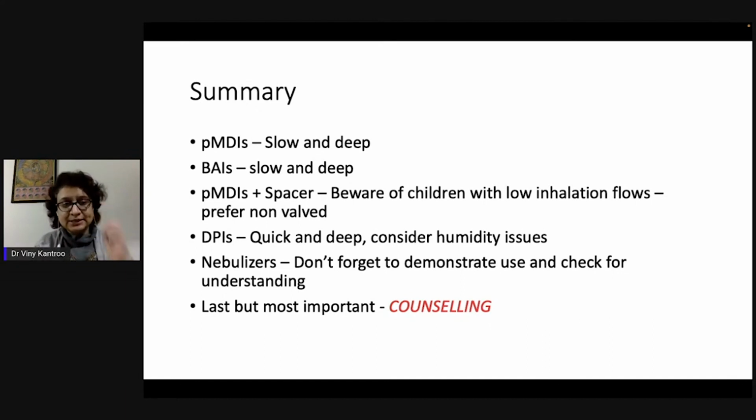On the other hand, if we see nebulizers, there is no particular action which is required for the inhalation. You can sit down completely, inhale deeply, and exhale according to your own comfort levels. However, in between, you should try to hold your breath for a period of 10 seconds for maximum amount of sedimentation which can happen inside of your breathing tubes. So, in nebulizers, do not forget to demonstrate the use and check for the understanding of your patient.